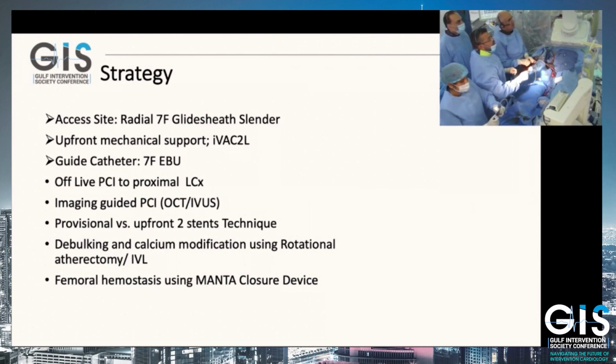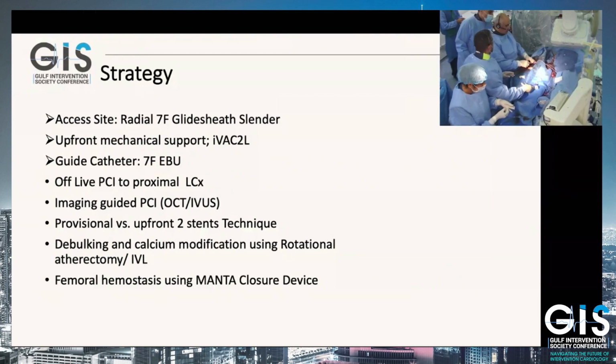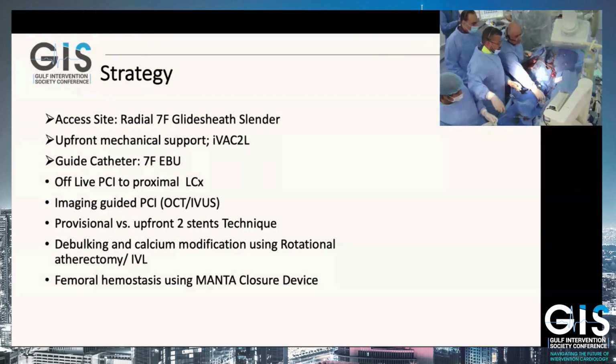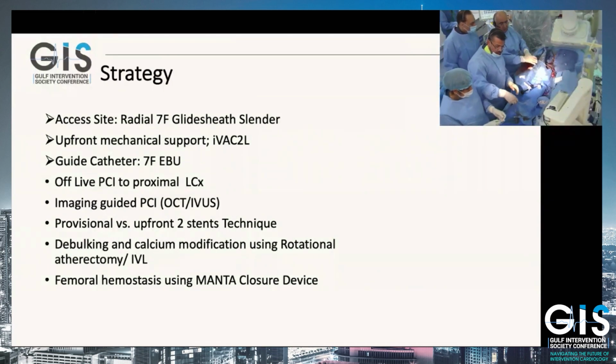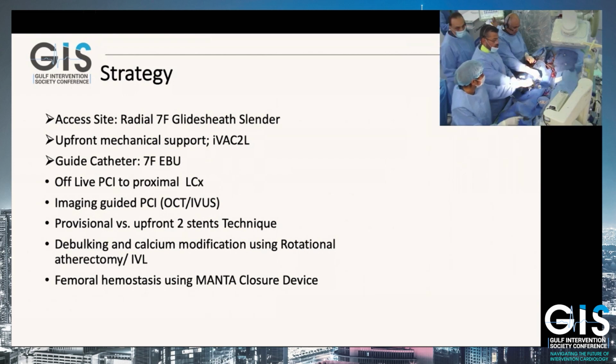Can I have a Sion wire? So we want to go through the right femoral artery with a 17 French sheath. Dr. Arif now is doing the LCX. We can optimize it later using imaging. All right, we will see what was done offline, or see live. Okay.